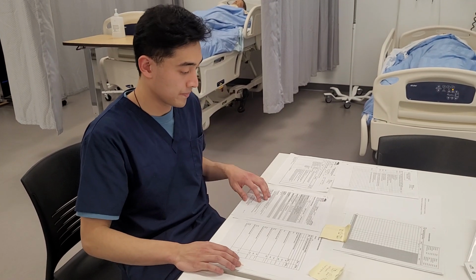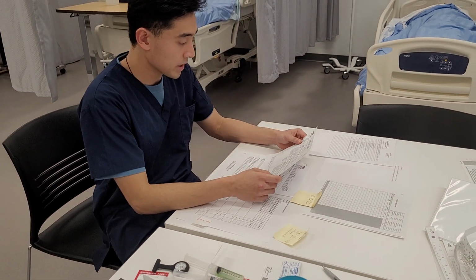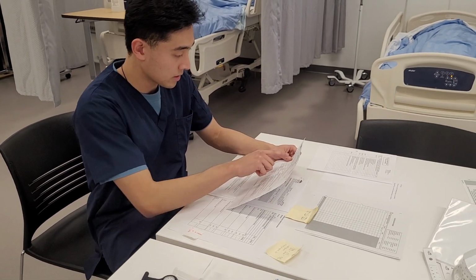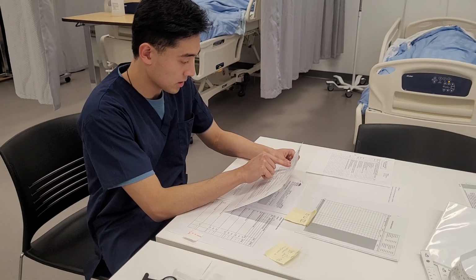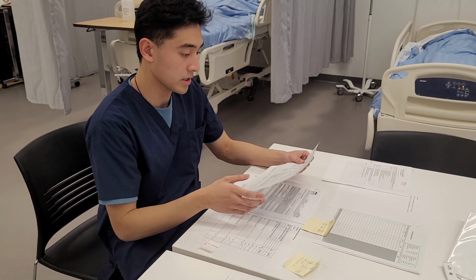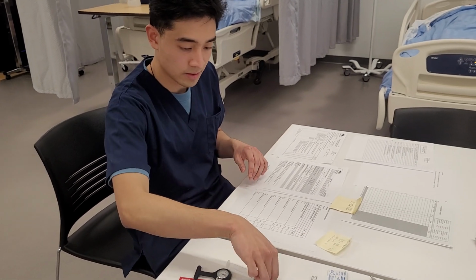and a tight chest. Alright. And then I'm also going to be checking their IV care plan to see if I need a dressing change. Nope. So this is going to be on their right arm, insertion site brachial, and the external segment is 5 centimeters, so that's good.